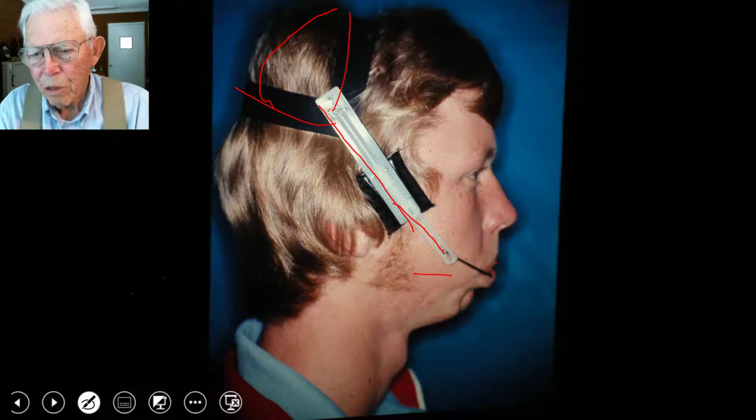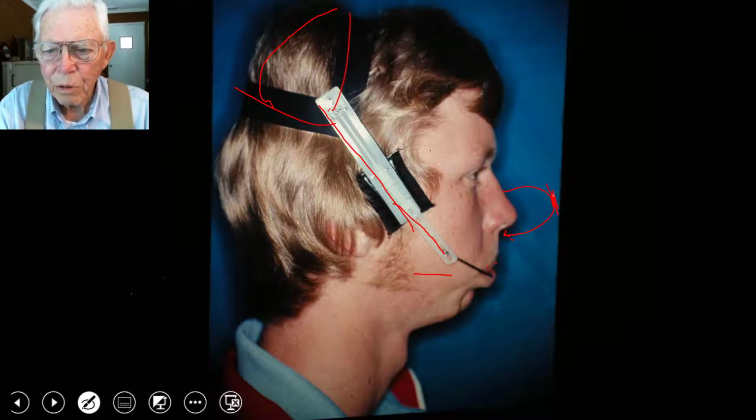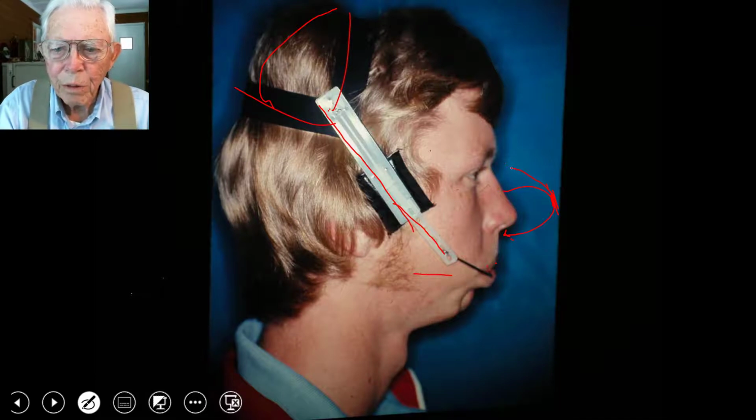Now, you take an occipital headgear, it will be something like you'll have a deal that goes into the teeth back here, and then you have a real heavy deal right here, and then you can come over to the side and you'll have these hooks. You'll have one over here too, like that.